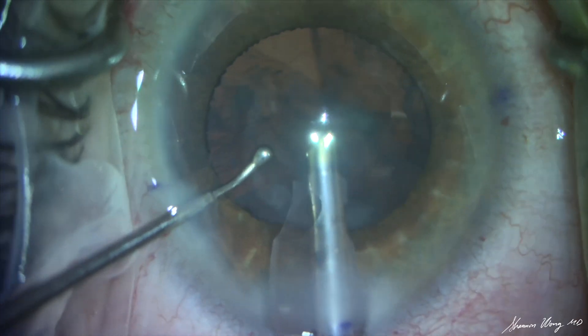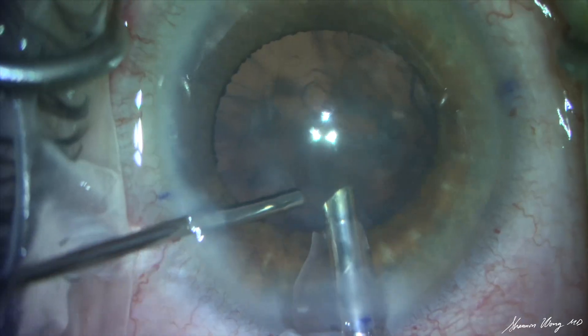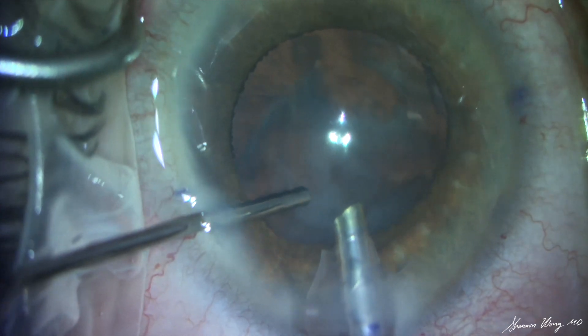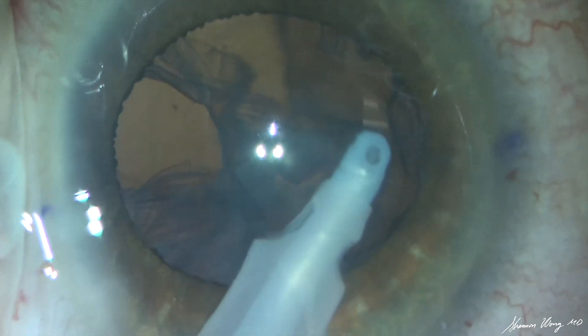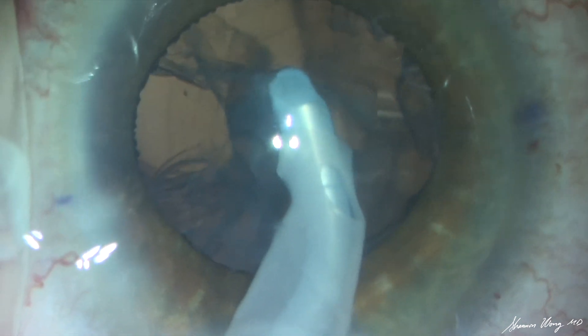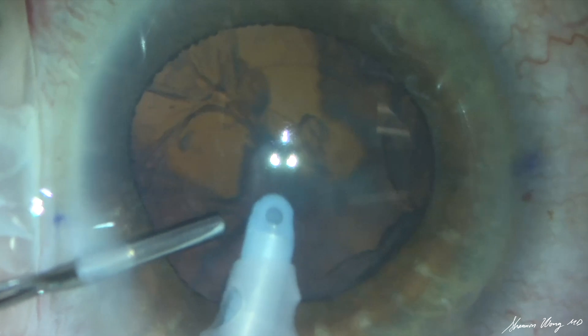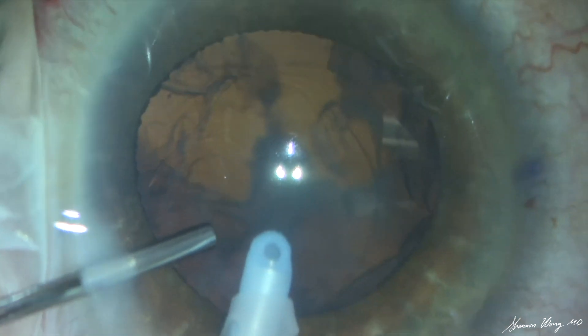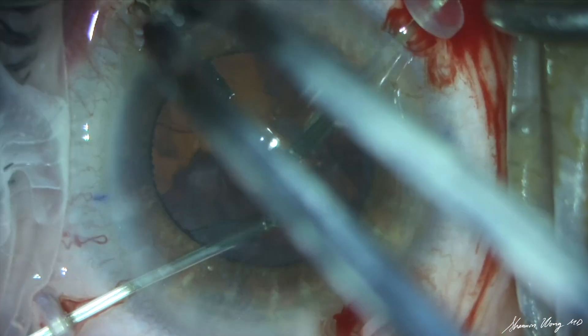Before we remove the phaco tip from the eye, we place additional viscoelastic to prevent collapse of the capsular bag and anterior chamber. Next we begin removal of cortex with the I/A tip, but as we see the anterior capsule edge at nine o'clock move centrally as the cortex is aspirated, the decision is made to place more viscoelastic into the eye and remove the I/A tip.